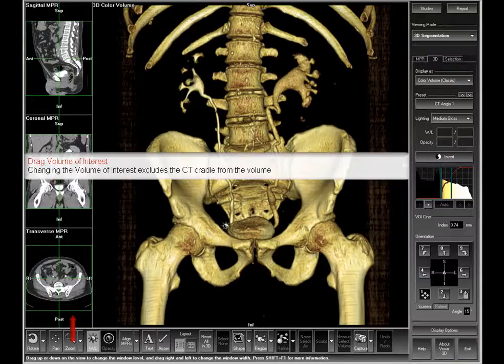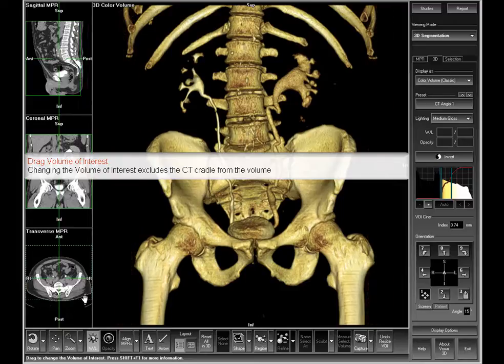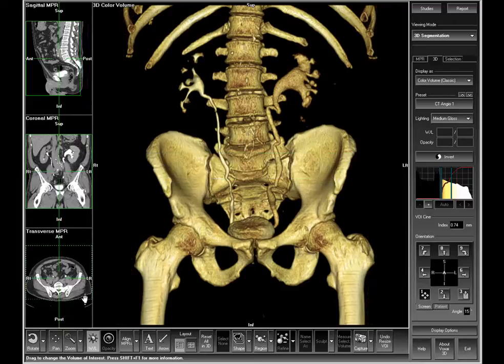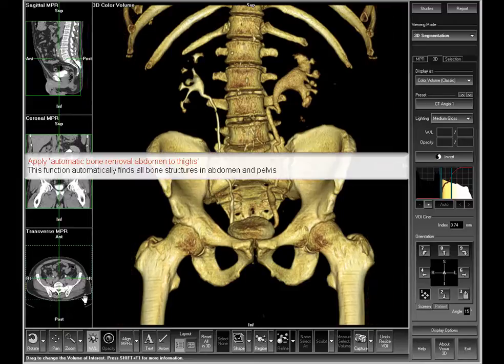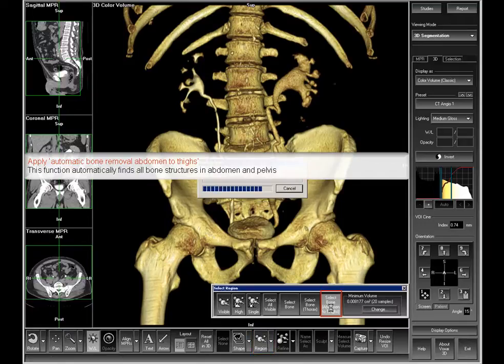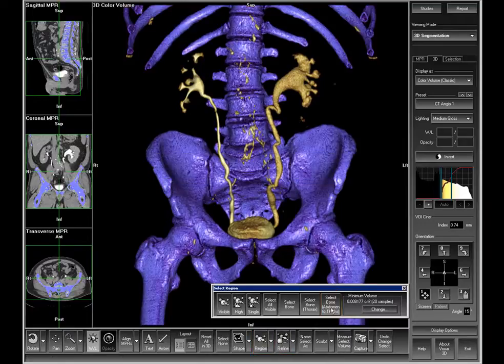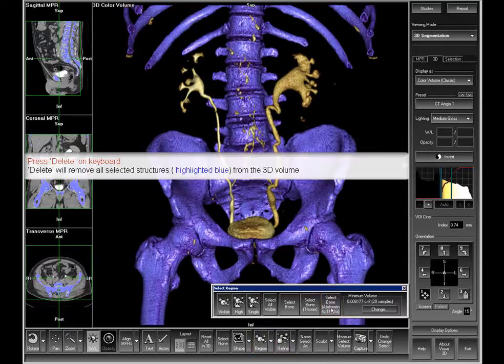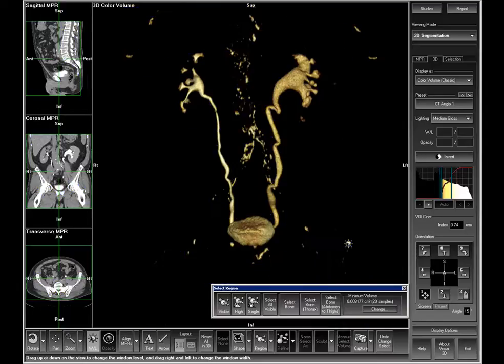Drag the volume of interest on the transverse image outline to remove the CT cradle. Use the automatic bone removal abdomen to thighs option from the region drop-down menu. This finds all the bone structures in the abdomen and pelvis automatically. Delete the bone by pressing the delete key on your keyboard.